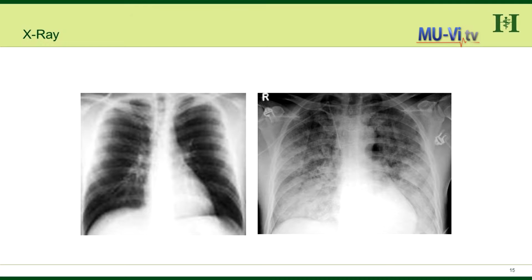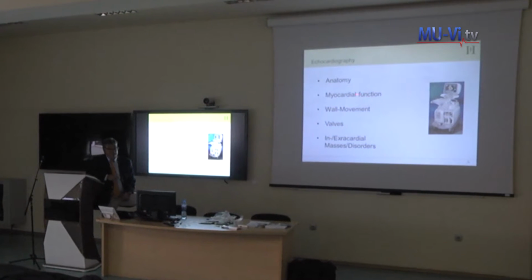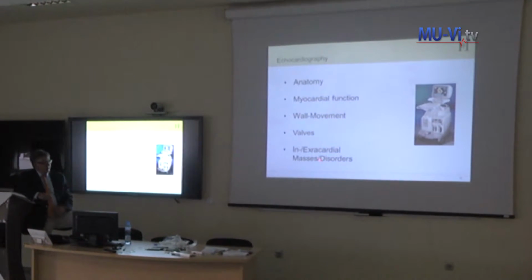It's water. What can echocardiography do? Echocardiography is beautiful. It's non-invasive. It's cheap. It's fast. And it's very, very nice because we see very much. We see the anatomy of the heart, the myocardial function, the wall function, the kinetic, the movement, the valves, and intra- and extracardial masses.